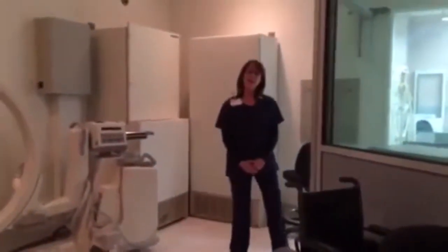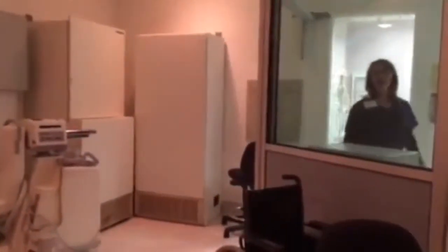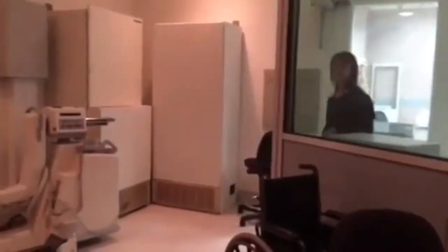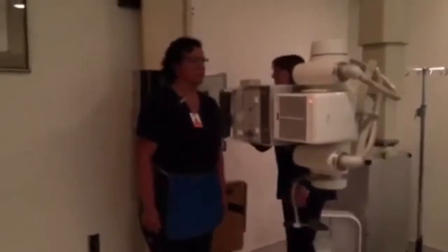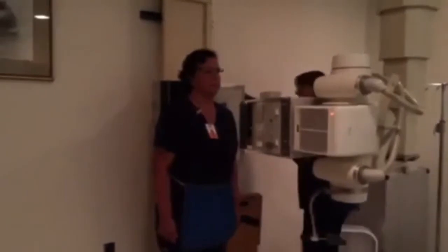You okay, Mrs. DeWitt? Yes. Okay, good. All right, so my technique is going to be 70 kV at 6 mAs. Hold real still for me. Don't breathe. X-ray. Good. Okay, you can relax, Mrs. DeWitt. All right, I'm going to get my cassette. I'm going to set it to the side. I'm going to grab my new cassette, 10 by 12 again.